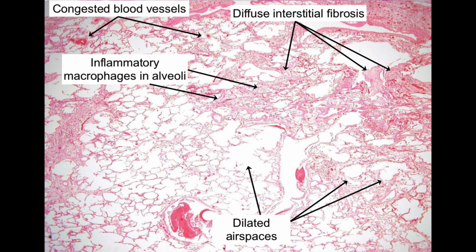Contraction of the fibrous tissue distorts the native architecture, creating large air spaces enclosed with thick fibrous walls. In this way, the affected regions, usually the lower lobes of the lung, become honeycombed. Some bronchioles will have developed a stratified epithelial lining as evidence of metaplasia.